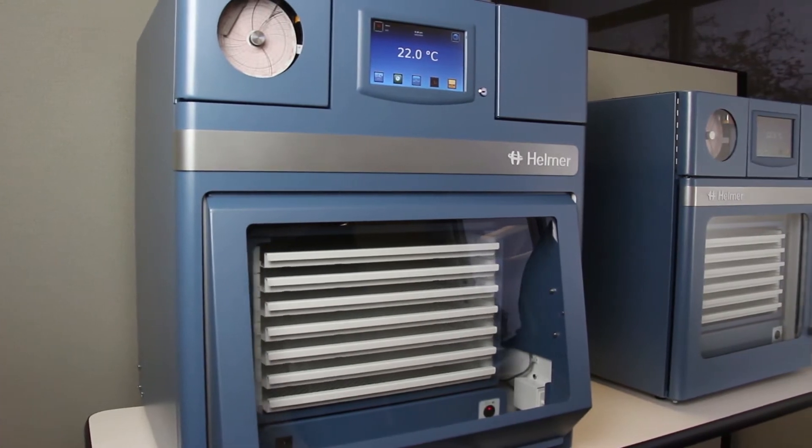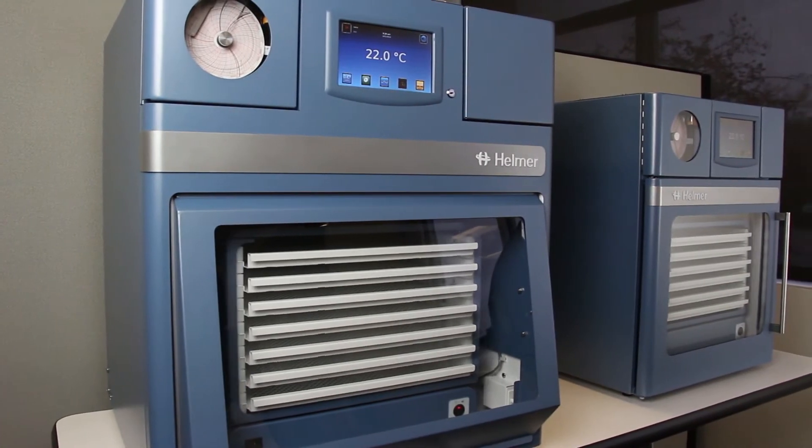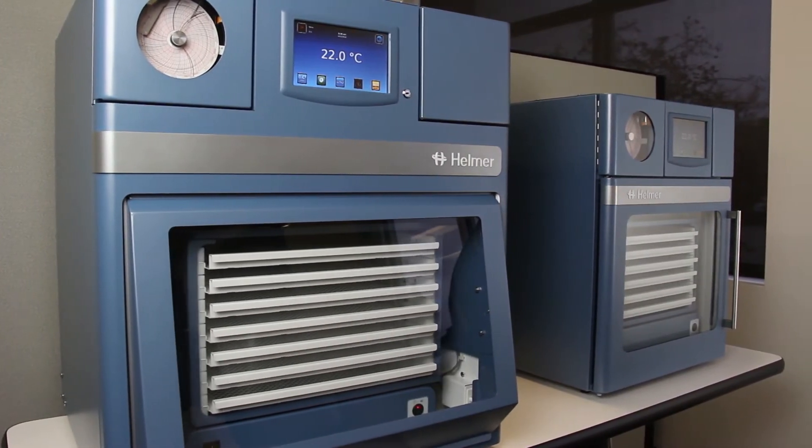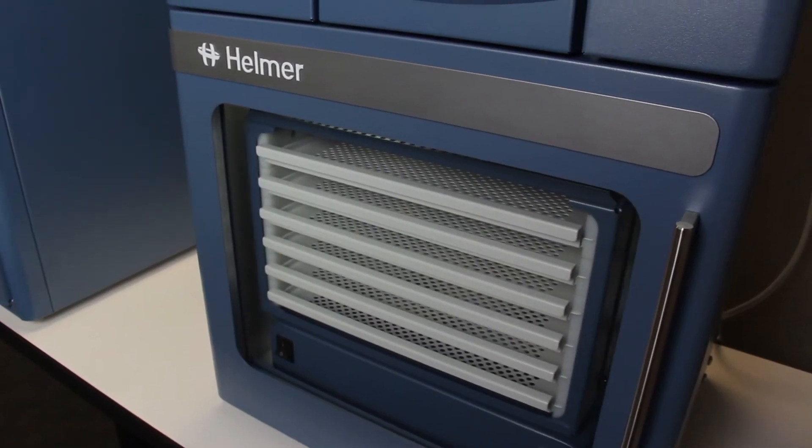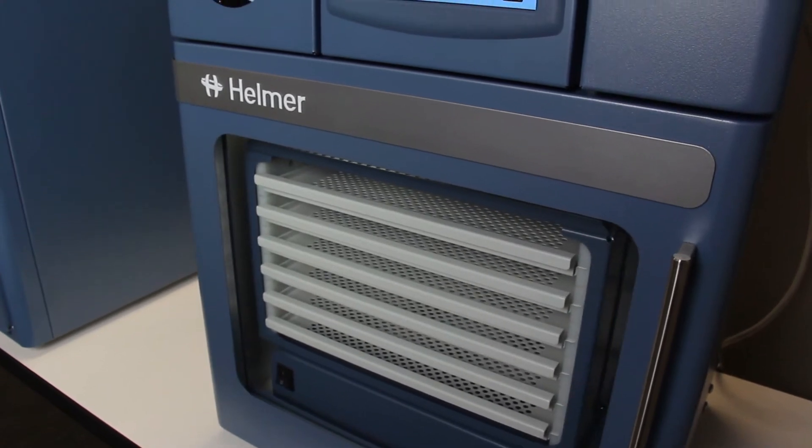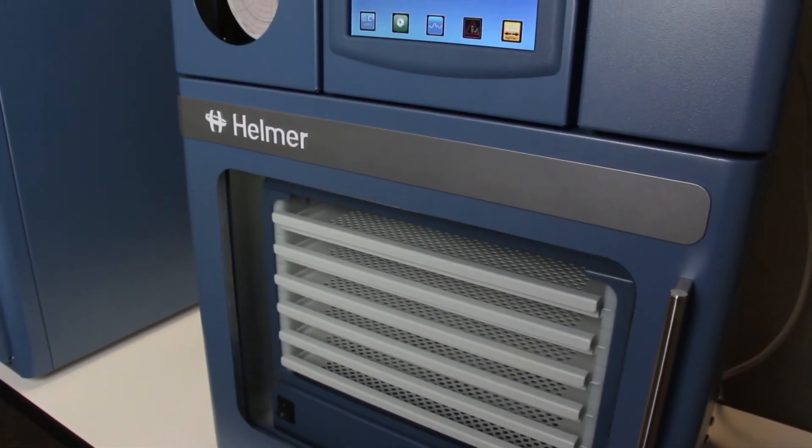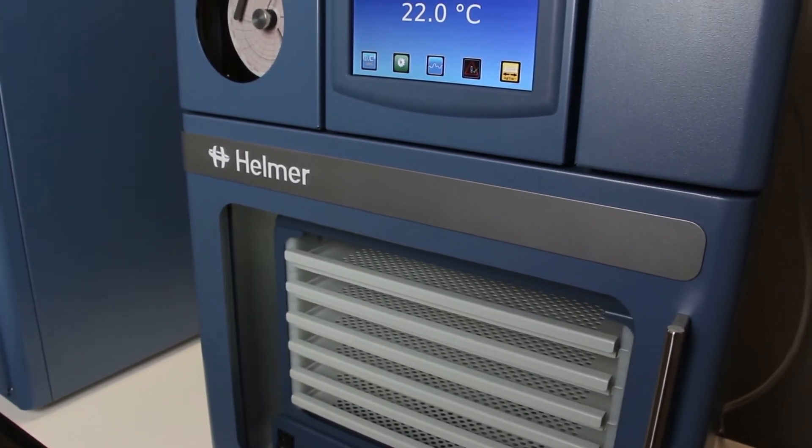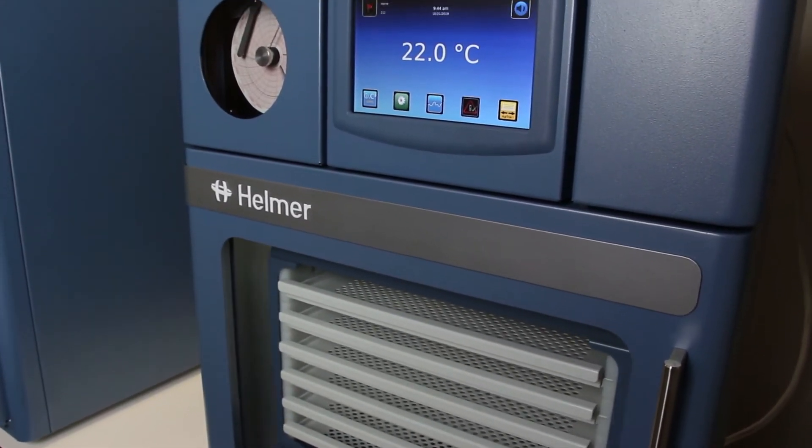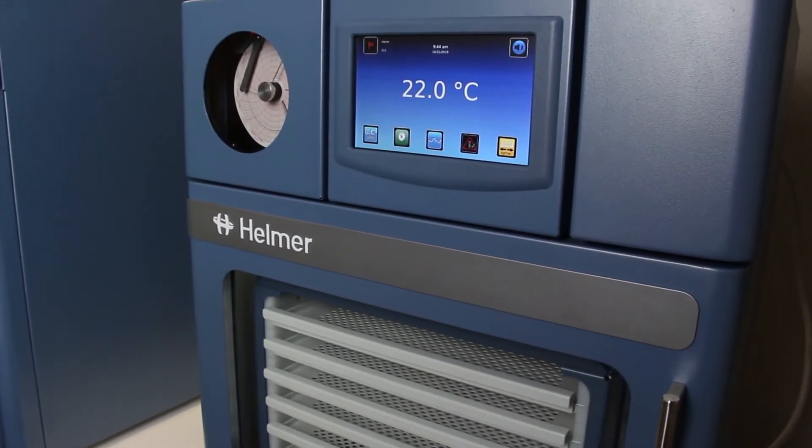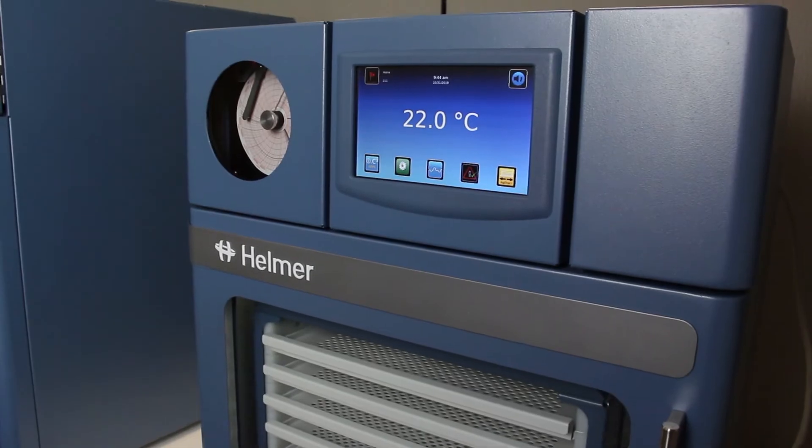ProLine countertop platelet storage systems from Helmer Scientific leverage innovative technology to create a system that provides reliable, efficient, and sustainable performance.